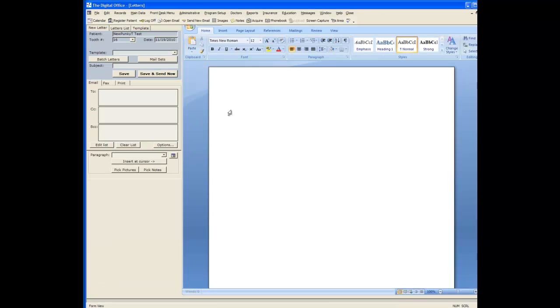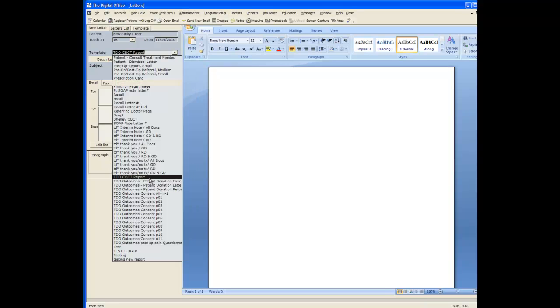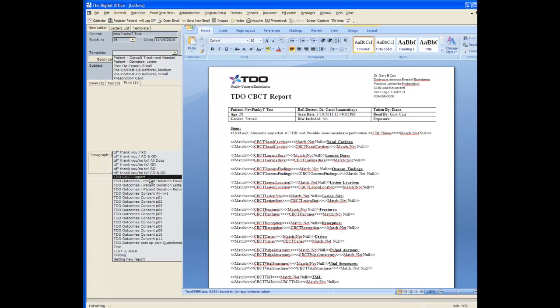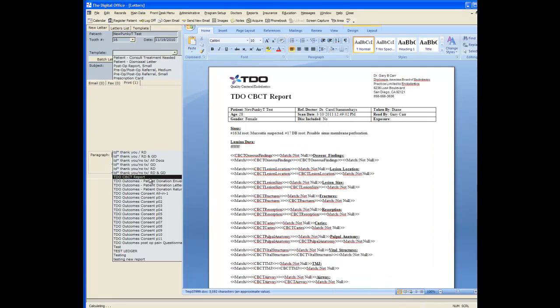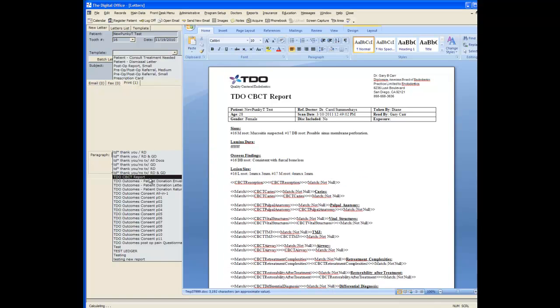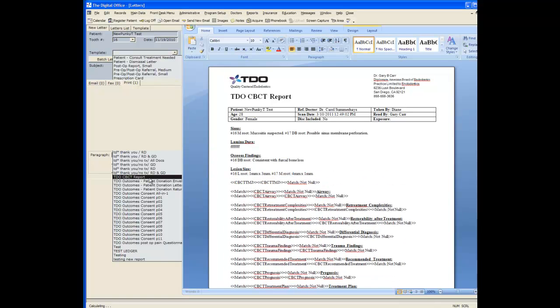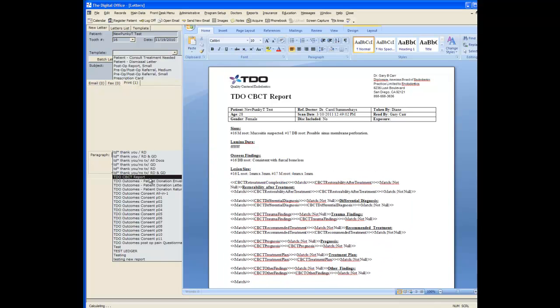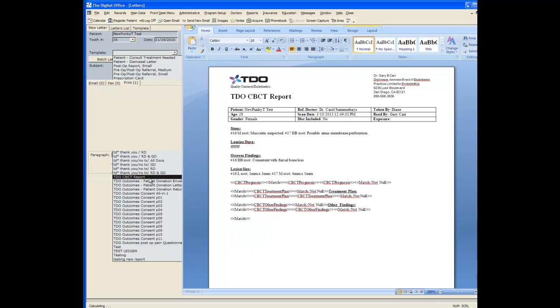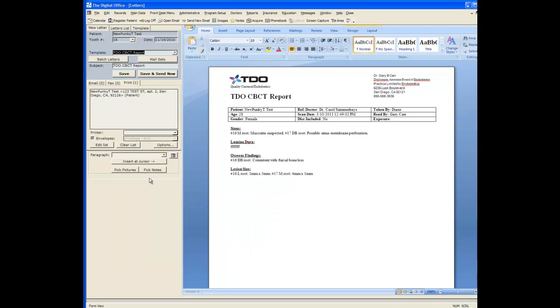TDO comes installed with a report called TDO CBCT report. You can customize this to meet your needs but the way it's designed is it's going to go through all of the different findings categories and only show those on the report where you entered some information. For example on my report there's only four items that I filled in information on.